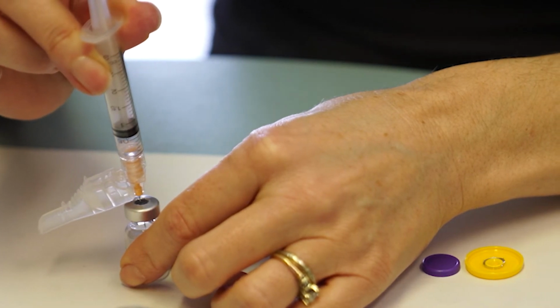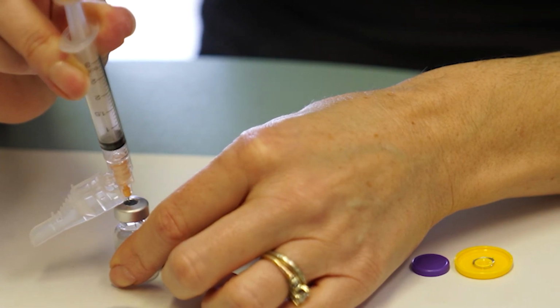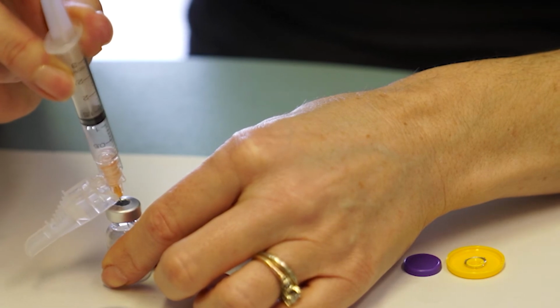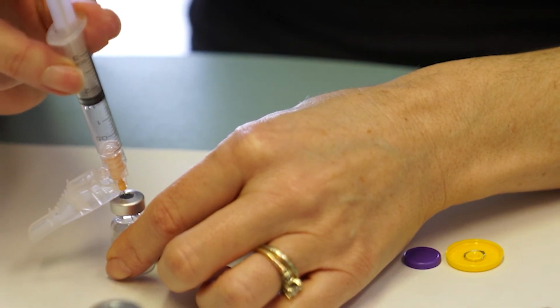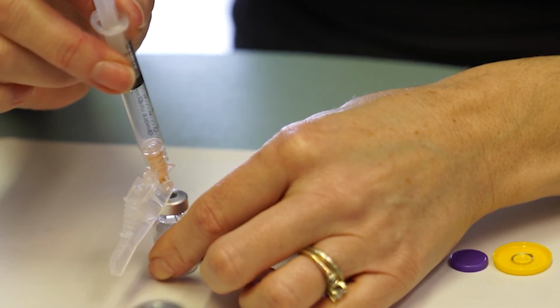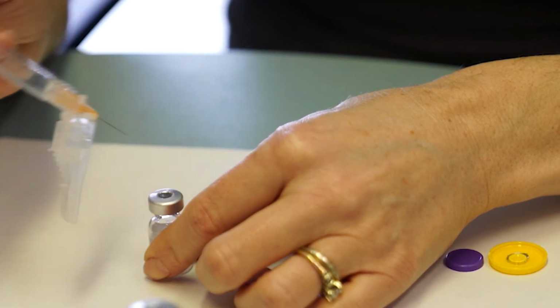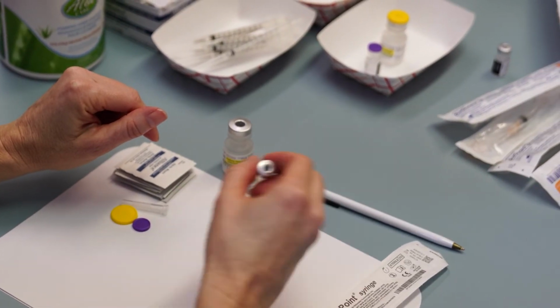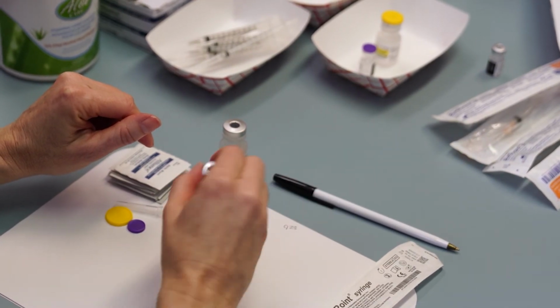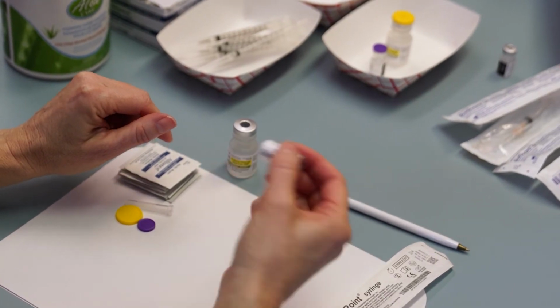With the syringe still above the vial and the bevel of your needle out of the fluid, gently and slowly withdraw the plunger to the 1.8 mL mark. Your syringe, now with 1.8 mL of air, can be taken out of the vaccine vial. Discard this syringe in your sharps. Invert the vaccine 10 times slowly and methodically so as not to get any bubbles in the vial. You are now ready to start withdrawing the 0.3 mL doses.